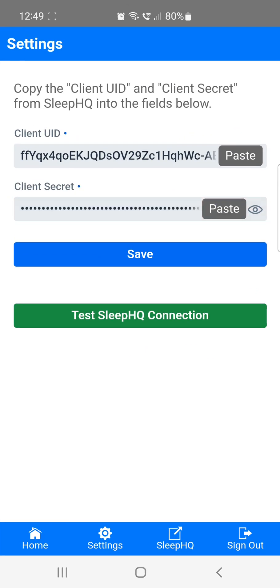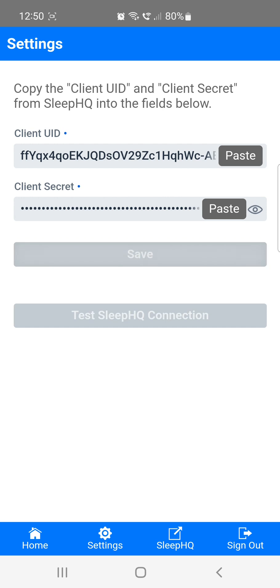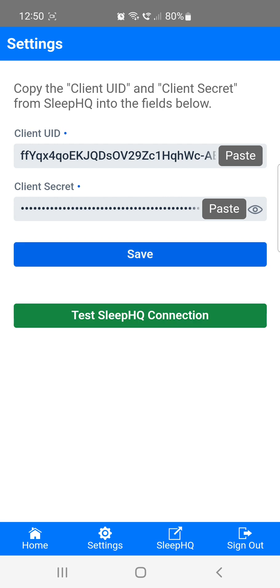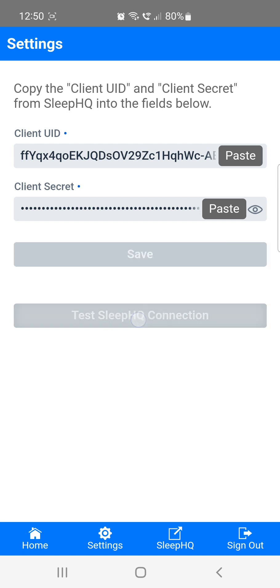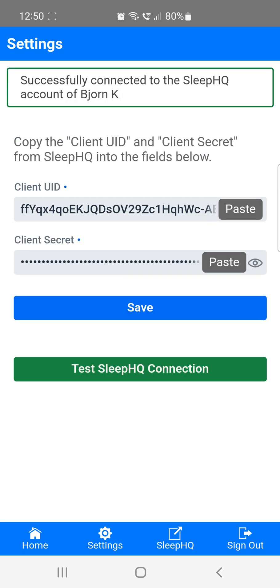Once you've pasted both credentials, tap on Save. If everything went well, the Sleep Data app should now be connected to Sleep HQ. To check the connection, tap the green Test Sleep HQ connection button. After a few seconds, you'll see a message that says successfully connected to Sleep HQ.